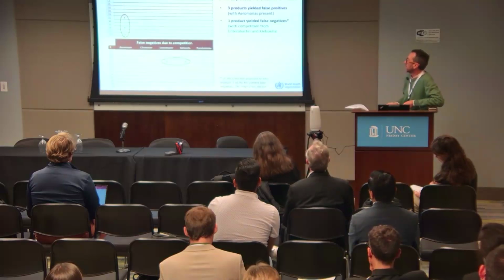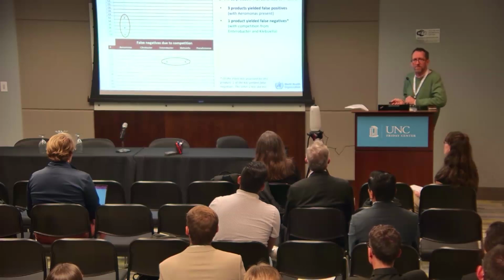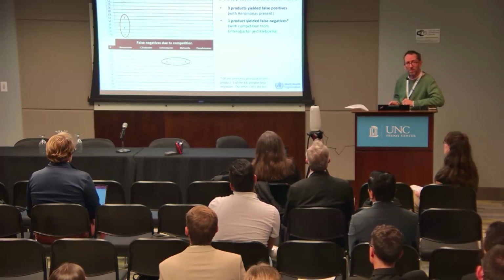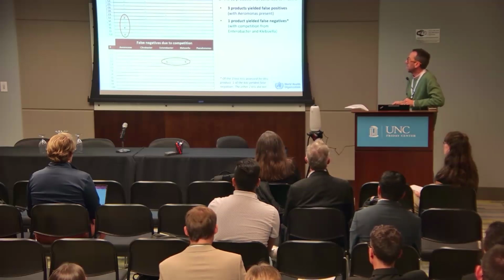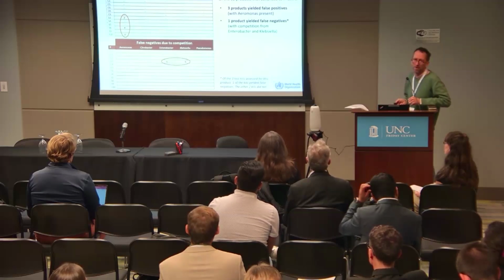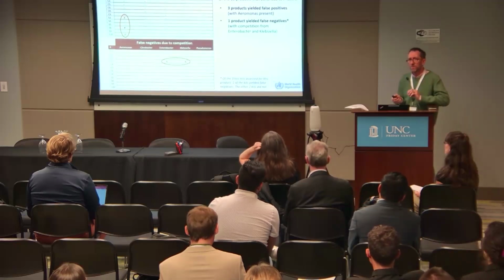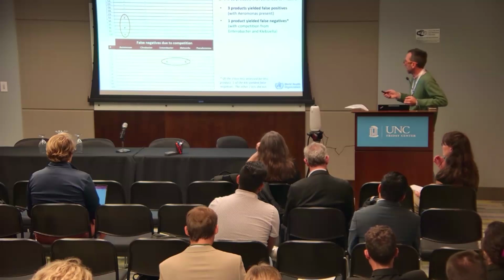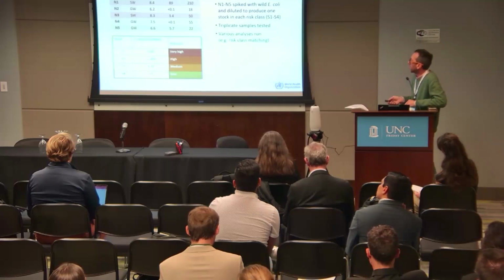So some of the phase 2 results, first on the false positives and false negatives, we didn't find very many problems. There were a few tests that did yield slightly positive results for Aeromonas, so that could be of concern with those products. And then there was one test that didn't show E. coli when there was also a lot of Enterobacter or Klebsiella in the system. So some possible difficulties with, I guess, sensitivity in that product. But by and large, no big issues there.